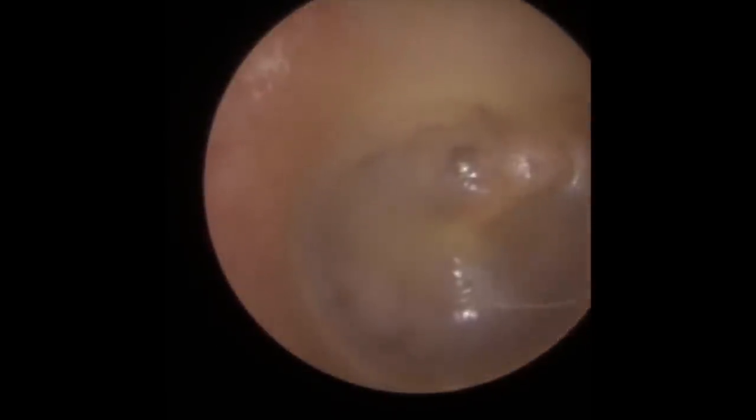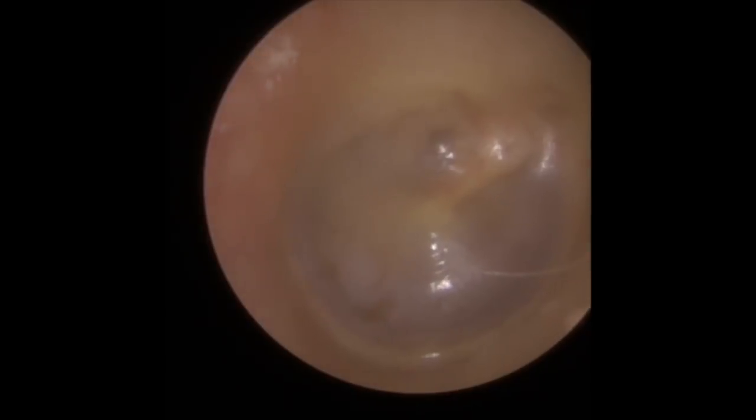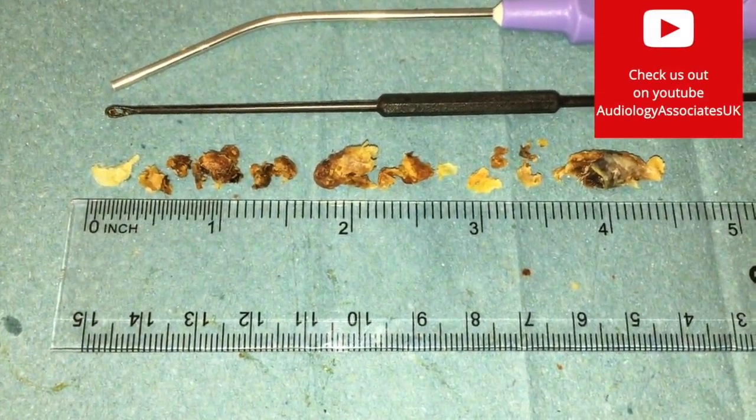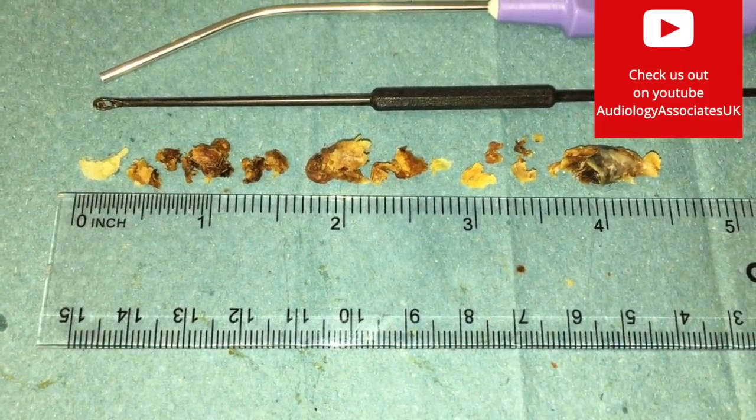You can see quite a long sausage-shaped piece of wax come out there — a lot of this came out in one big chunk. There is the eardrum. You can see a slightly better light reflex on this side. So this is what we removed — we measured it in inches as a few people asked if we could do that. It is about four and a half inches of wax there.